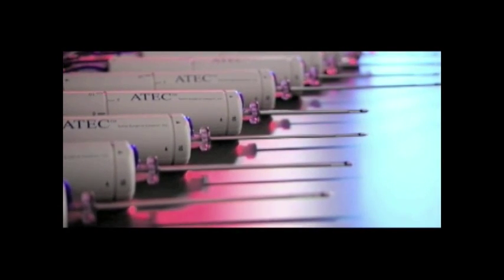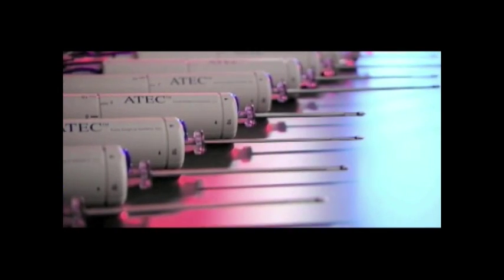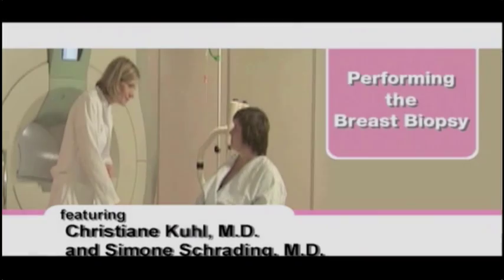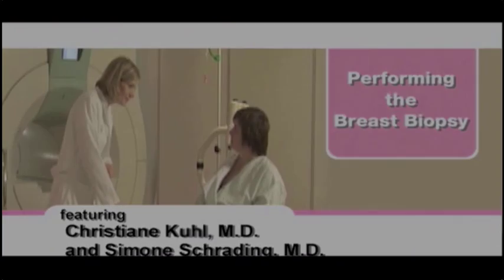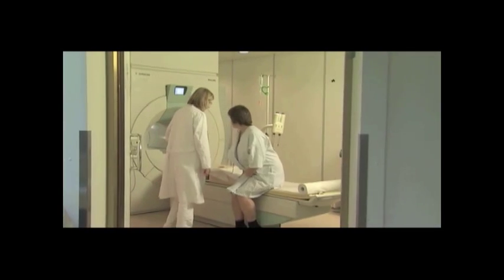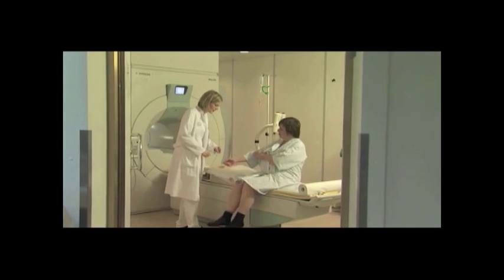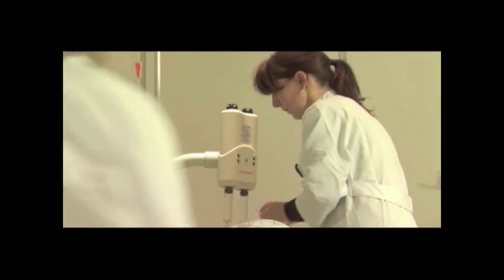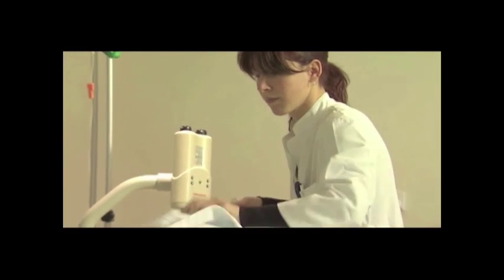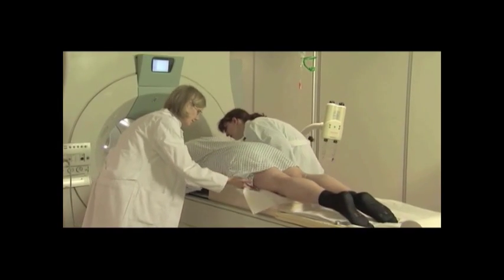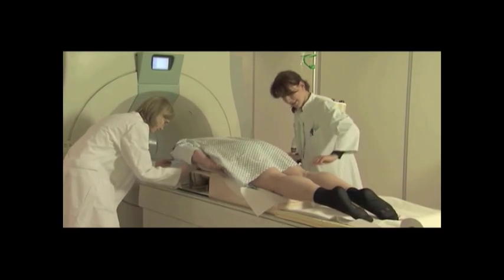The standard Atec MRI handpiece is used during the procedure. Once the patient arrives in the MRI suite, an IV is started to facilitate the injection of the contrast agent to aid in visualization of suspect tissue. The patient should be reminded of the importance of remaining still during the procedure.